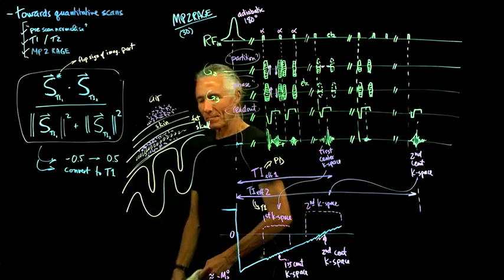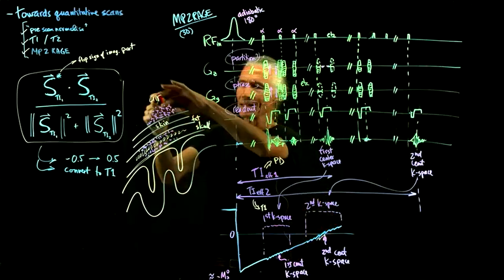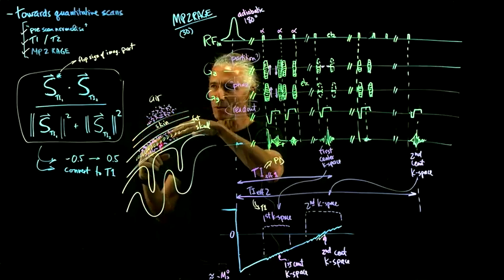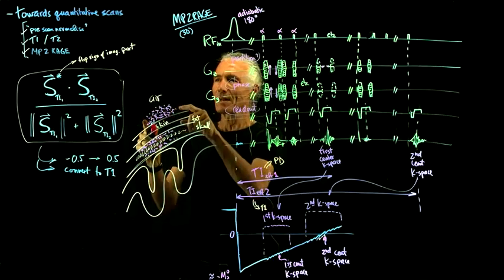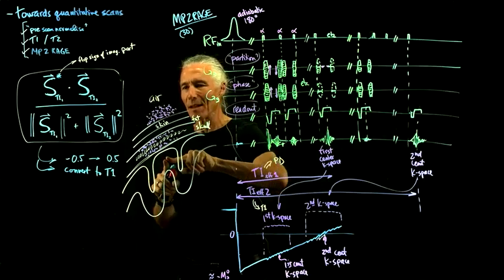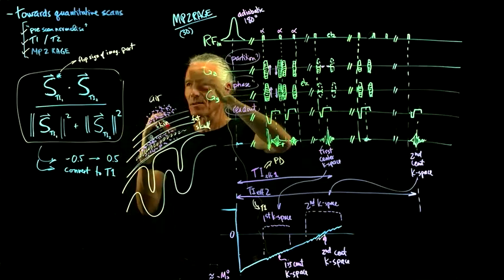So you could fix that. You could take the proton density weighted image, which does have black out in the air, and use it to mask out all that junk and maybe try to find the skull. It's a little harder to find the skull because you have to somehow find out where the skull is in order to mask it. The air is relatively easy because you could just turn off anything that's black outside. There's some black stuff in here, and the proton density image is not going to distinguish that black from that black, but if you shrink a surface onto the skull, we can get rid of the noise outside the skull.